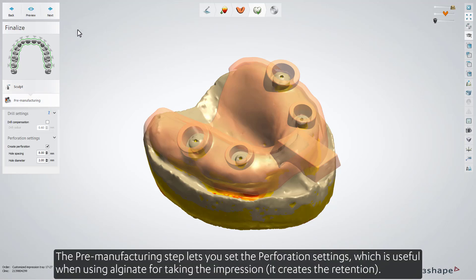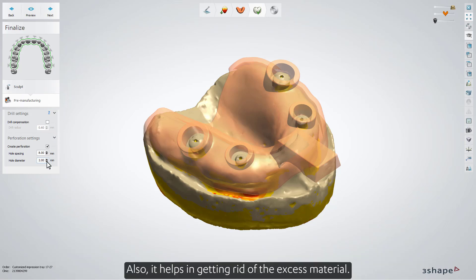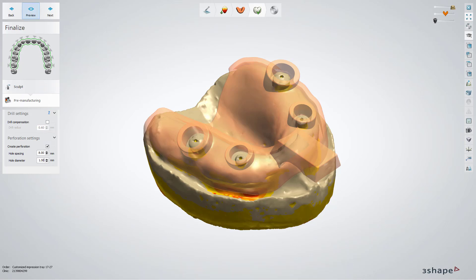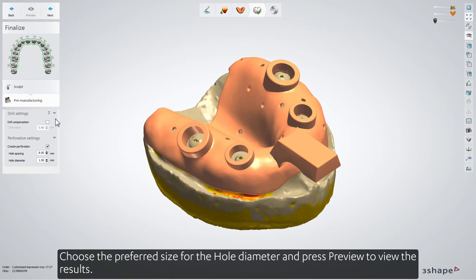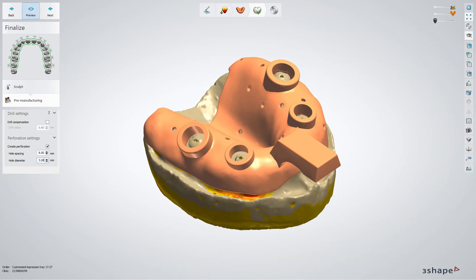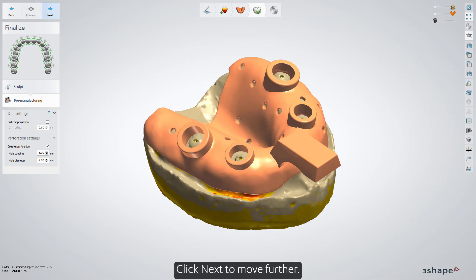The pre-manufacturing step lets you set the perforation settings, which is useful when using Alginate for taking the impression. It creates the retention and helps in getting rid of the excess material. Choose the preferred size for the hole diameter and press Preview to view the results. Click Next to move further.